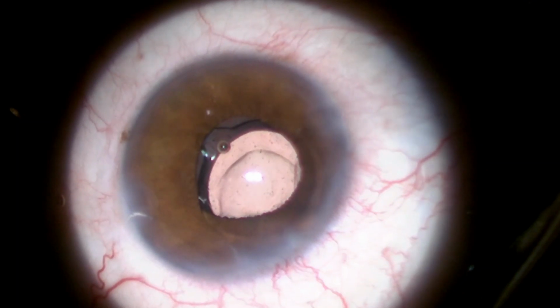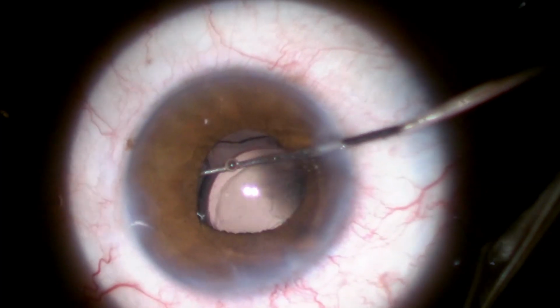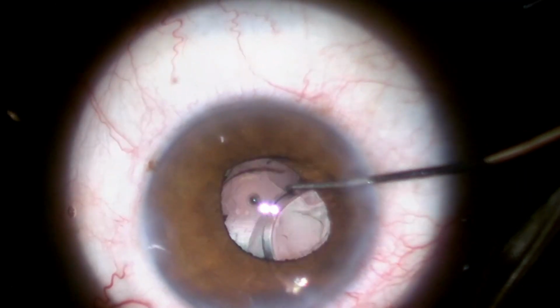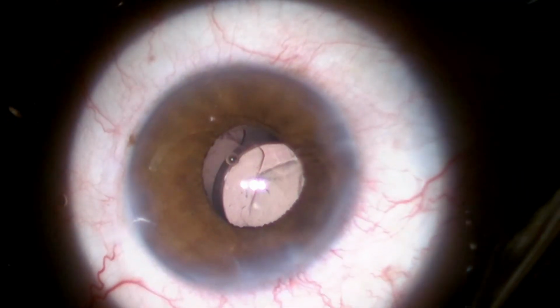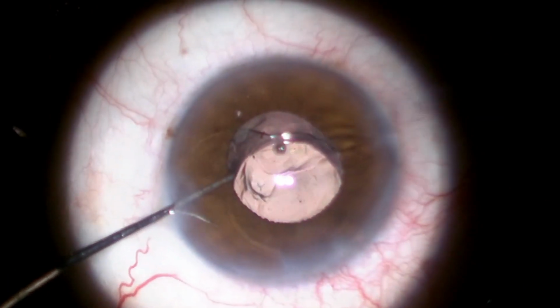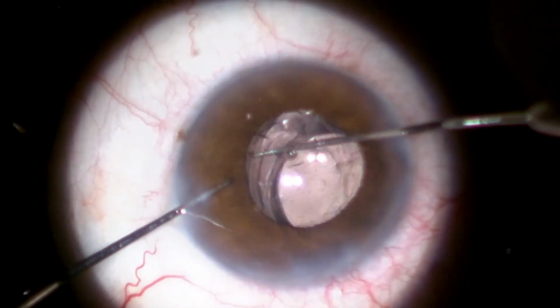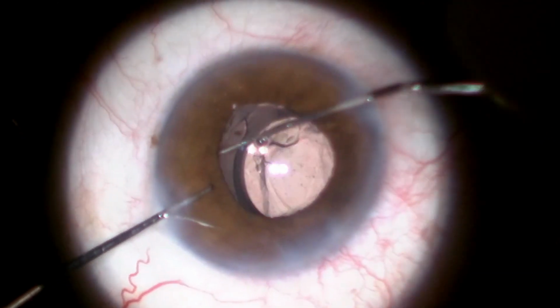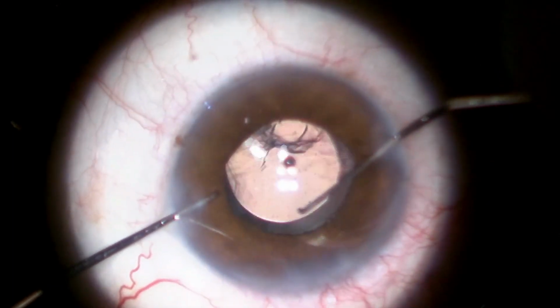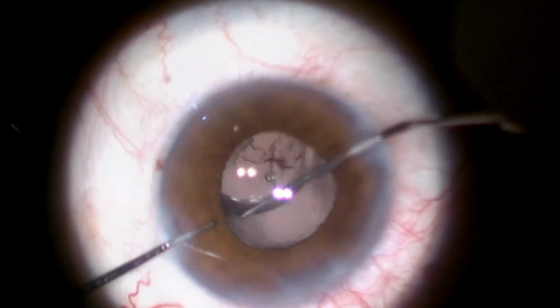But I think this is behind the capsule, so we will be replacing it. So I have brought this haptic again over the iris, and again I have repositioned this haptic so that it goes into the sulcus, and with gentle dialing of the lens we have placed the IOL.